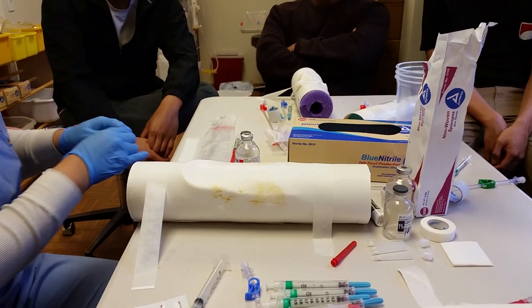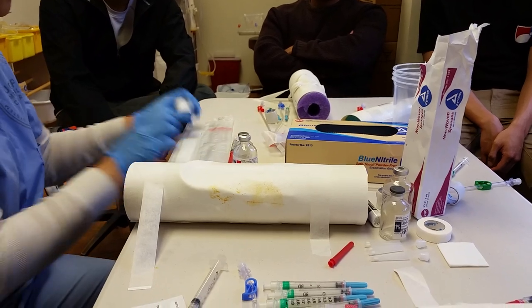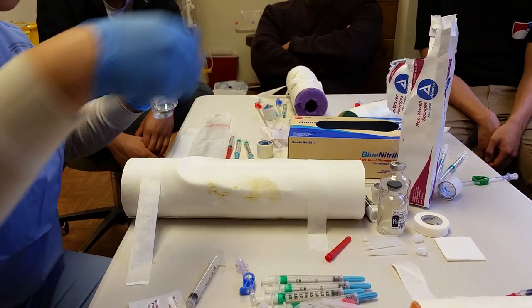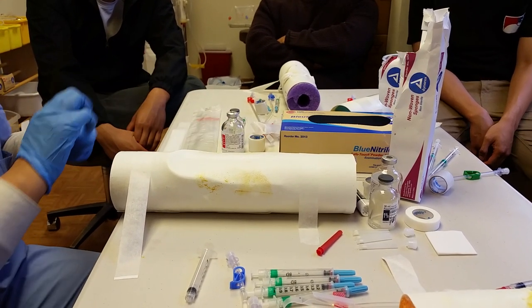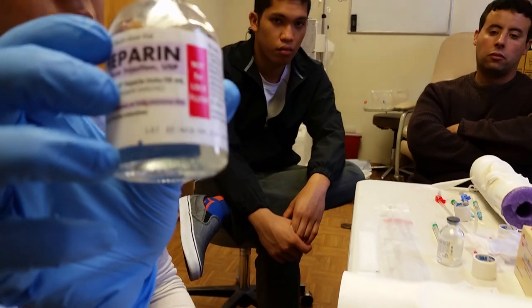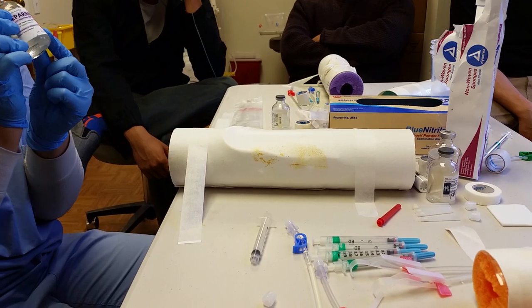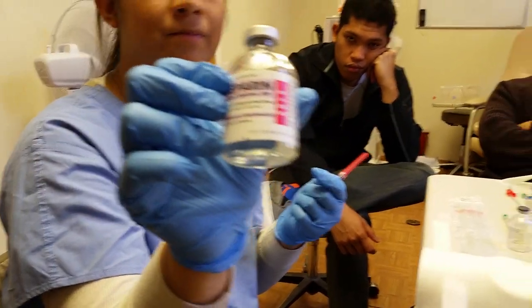What I normally do is prepare everything before I cannulate the patient. Even when they get in, it's always important — you want to be organized and have everything ready. You want to get the heparin. Let's say the patient gets a thousand units of heparin. Whenever you look at a heparin bottle, you always want to make sure the medication's not expired. If it's the first time you open it, you always want to put your initials and the date you opened it, because after 28 days it's no good — you throw it away, even if it's not expired by the label date. It's good only for 28 days.